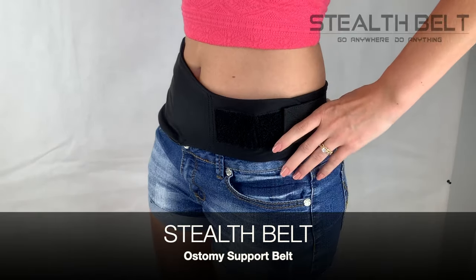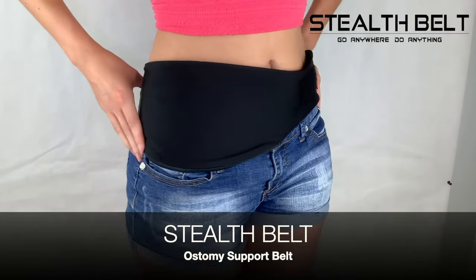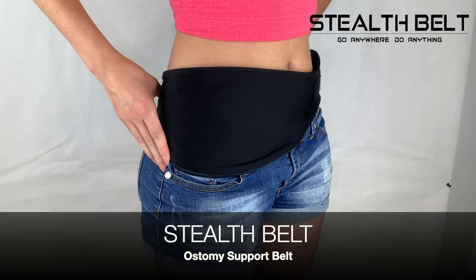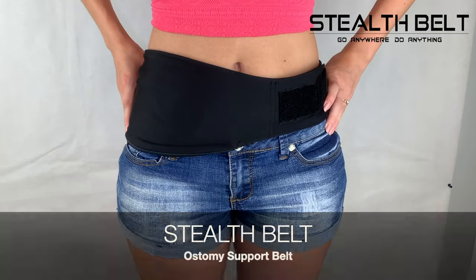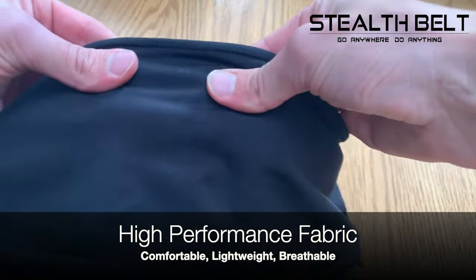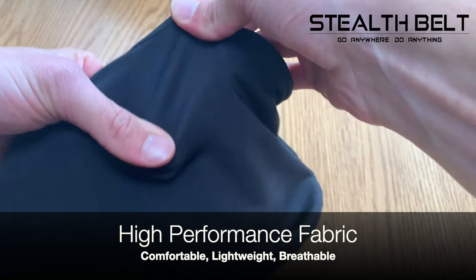A Stealth Belt is a custom ostomy support belt that is specially designed to hold your ostomy appliance securely and discreetly in place against your body. Stealth belts are made from a high-performance, moisture-wicking fabric that is comfortable, lightweight, and breathable.